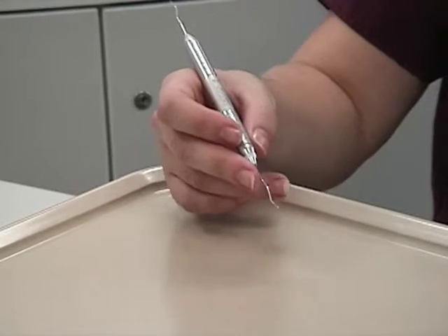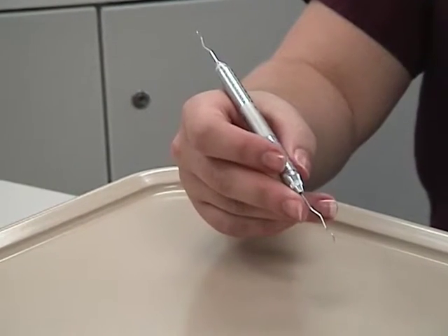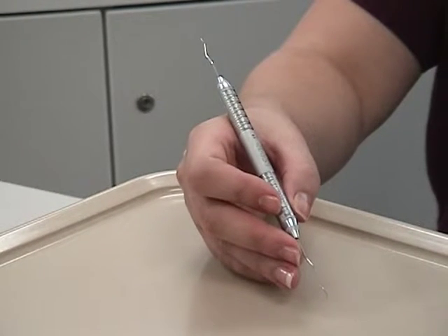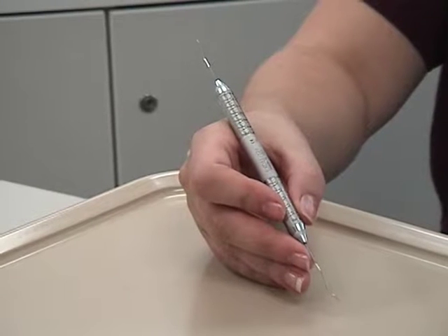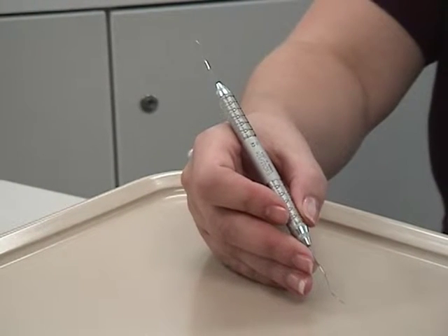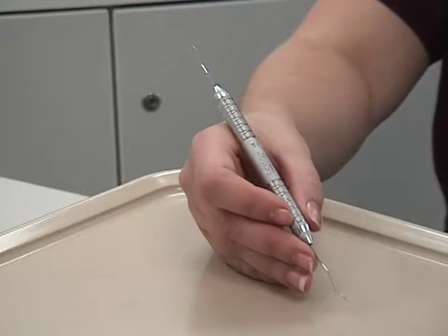The modified pen grasp is the key to instrumentation. It allows for precise control of the working end, permits a wide range of movement, and facilitates good tactile sensitivity. An improper modified pen grasp will prevent proper adaptation, angulation, or stroke. Each time you pick up an instrument, check your modified pen grasp.